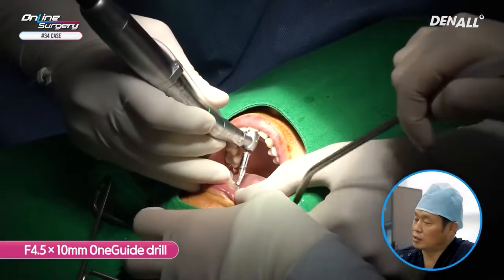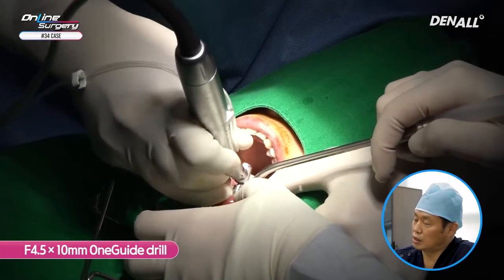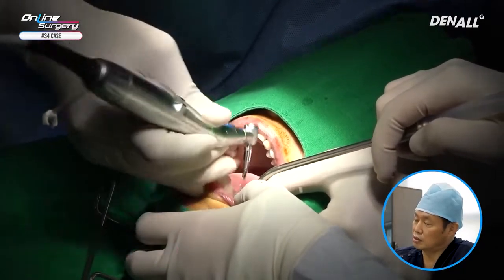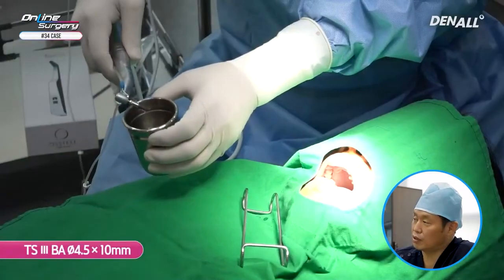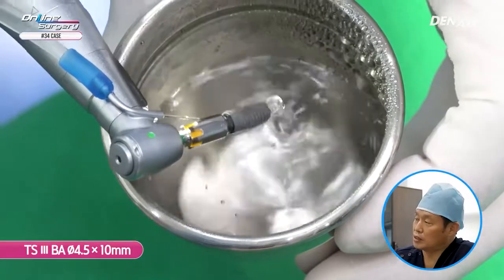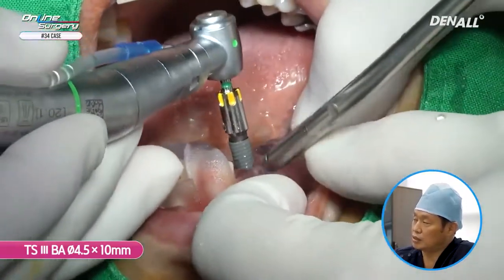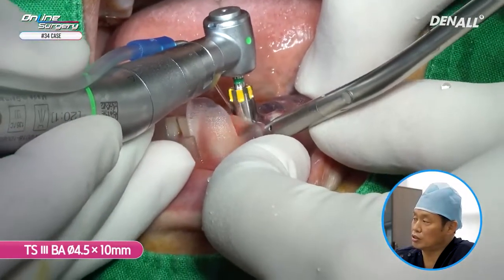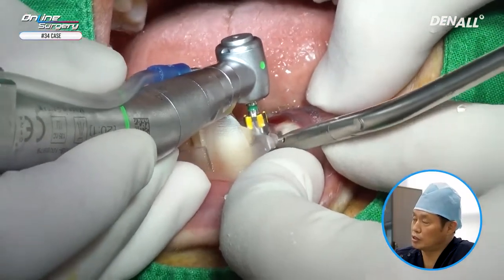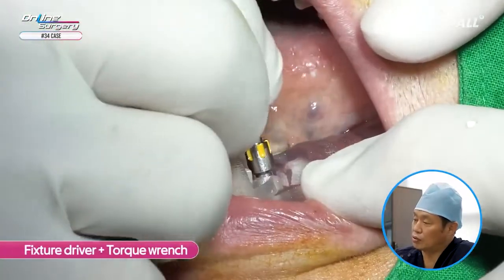For the final drill, a 4.5 by 10 mm one guide drill is going to be used. In order to reduce heat generation, I do a sort of pumping action. A TS3BA 4.5 by 10 mm implant is placed as mentioned. This is a hydrophilic implant. Before placement, you need to irrigate it sufficiently. Then, even if saliva gets on or there's contamination, the implant will not be covered by biofilm.